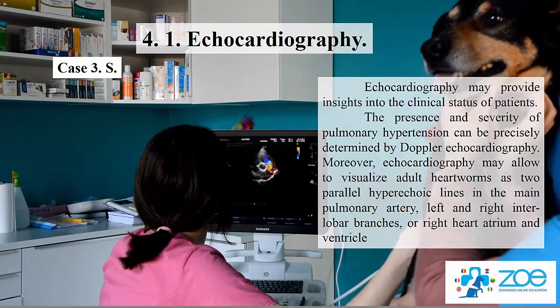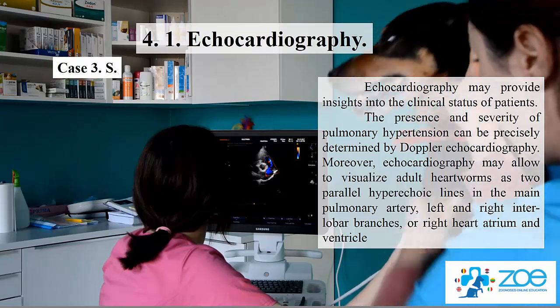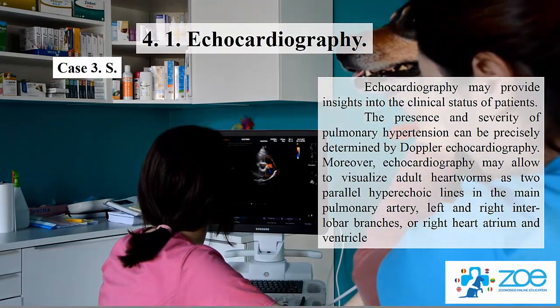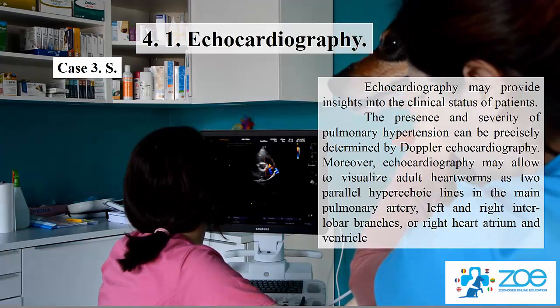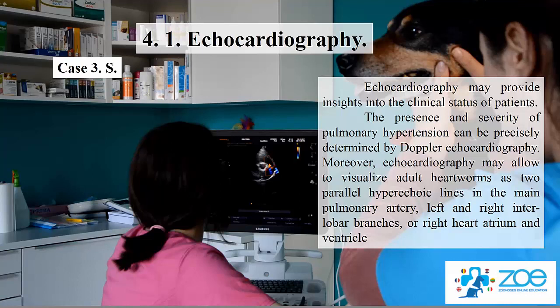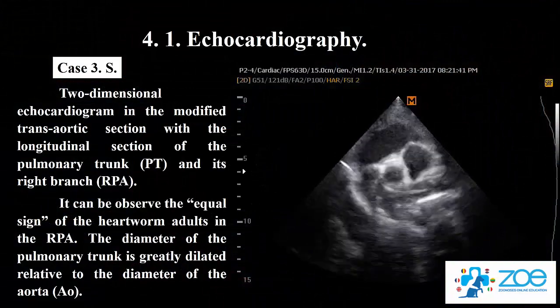The presence and severity of pulmonary hypertension can be precisely determined by Doppler echocardiography. Moreover, echocardiography may allow visualization of adult heartworms as two parallel hyperechoic lines in the main pulmonary artery, left and right interlobar branches, or right heart atrium and ventricle.